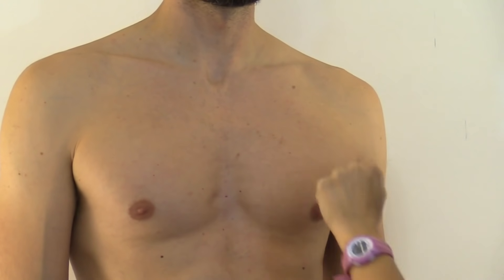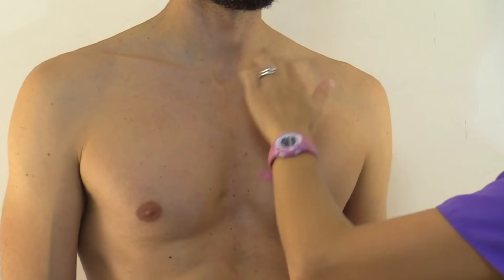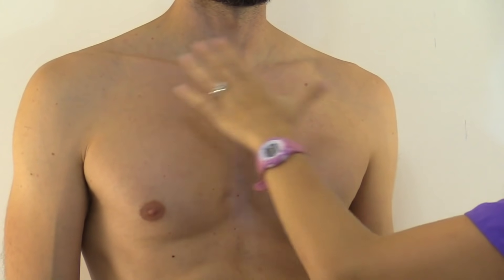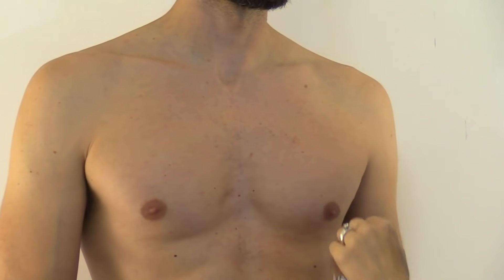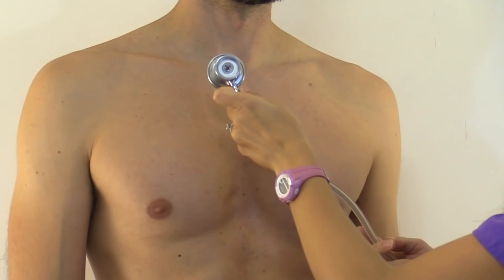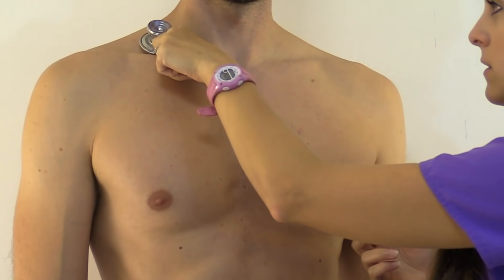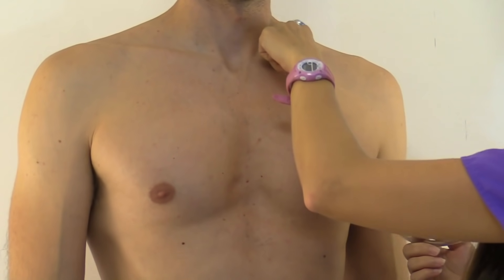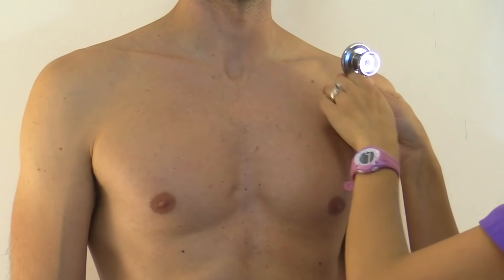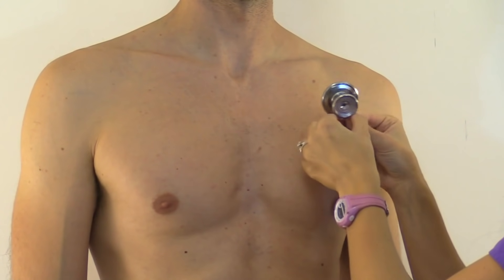First we're going to listen anteriorly using the diaphragm of our stethoscope. We're going to start at the apex of the lungs, always compare sides, and inch our way downward to assess all lobes of the right and left lung. We'll start up here at the apex — take a good deep breath in and out — then compare sides.